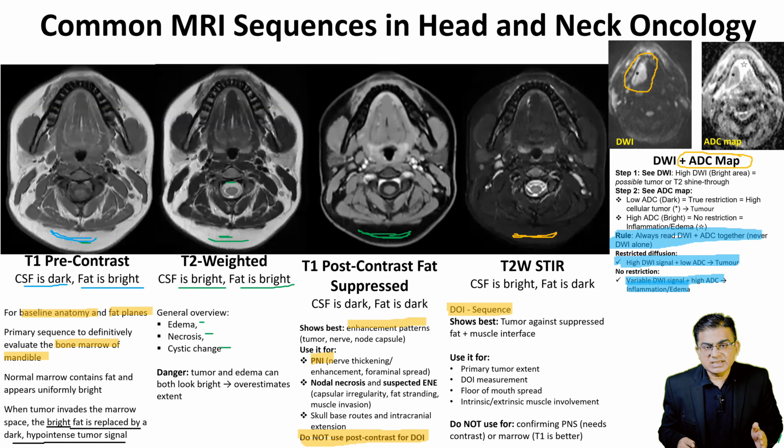Master these MRI distinct sequences. Your target volume delineation and surgical planning depend entirely on knowing which sequences to trust. I think this much is sufficient for you to know at this stage.